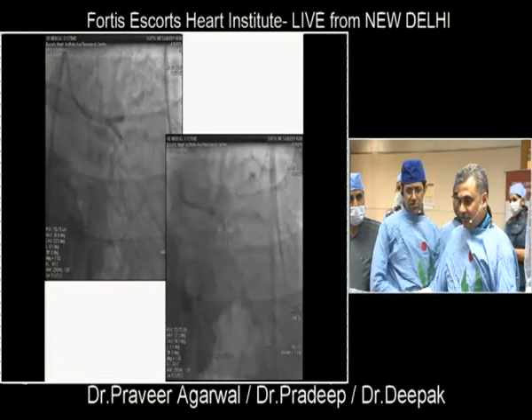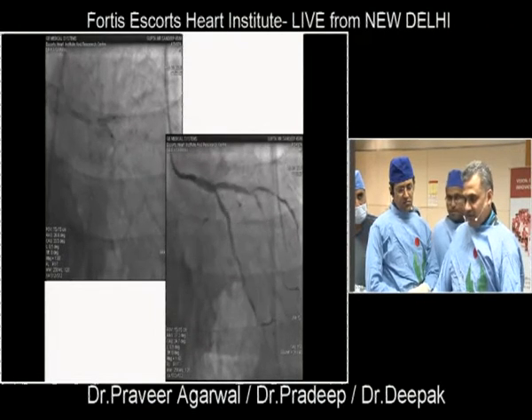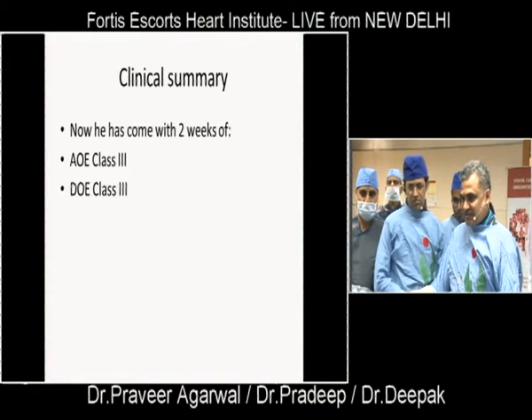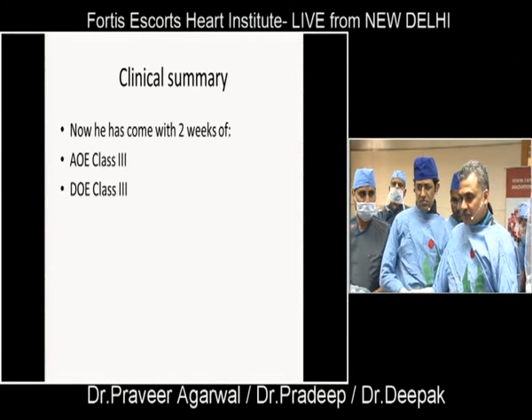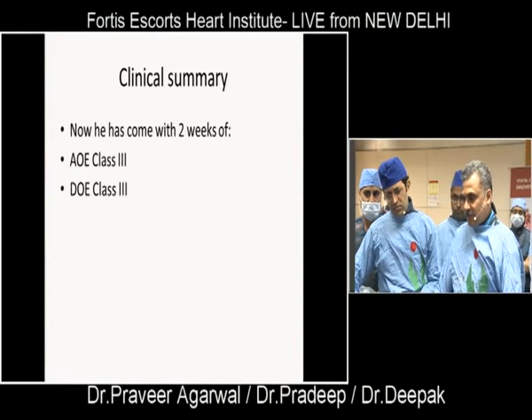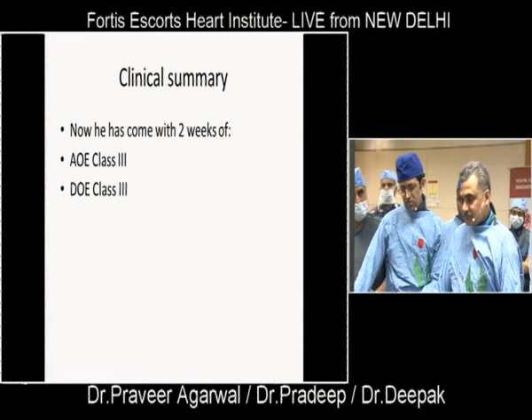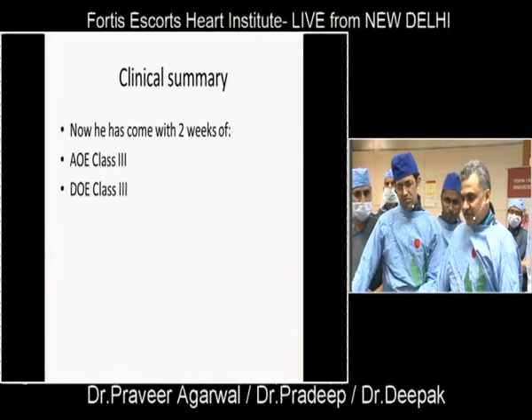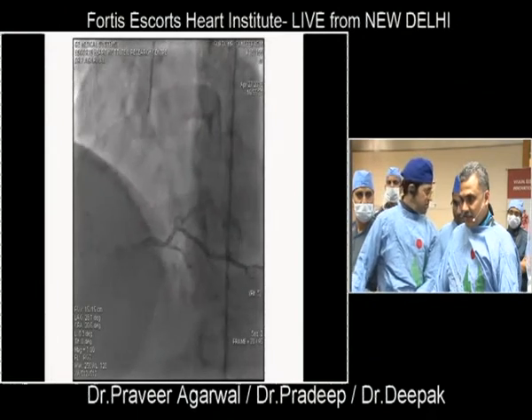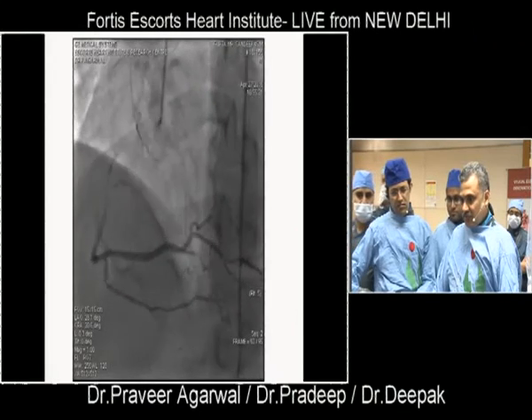Am I heard now? Yes, it's good. Okay, next please. So the patient comes again for the last 2 weeks with the same symptoms, angina on exertion class 3. He can barely walk for more than 5 minutes, and then he says that angina is there. Next slide, please. So we repeated the angiogram. The RCA is a large artery with a mild to moderate disease.